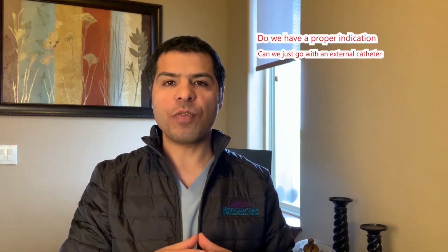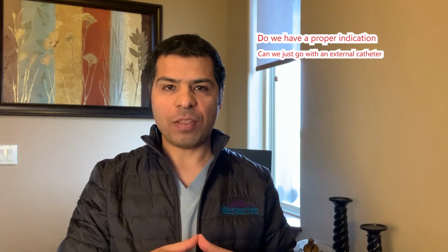Time to talk about troubleshooting of Foley catheters. But before that, the best way to troubleshoot is not to have to troubleshoot, which means before you place a Foley catheter or any type of urinary catheter, we should ask ourselves, do we have the proper indications for that? And if we need a catheter, can we go by just an external catheter instead of an invasive catheter?